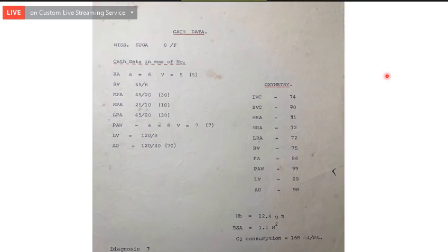Okay. But when this combination... AP window, sir, can it be AP window? It can be. I would go for PDA, but of course, you cannot rule out a small AP window. It's quite possible. But when there's a PDA with peripheral pulmonary artery stenosis, what is this combination?